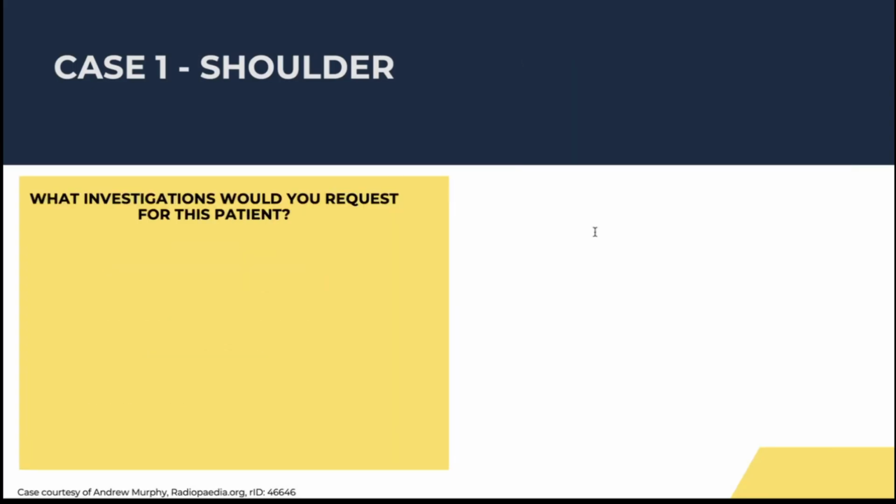And what investigations would you request for this patient? Well, given the nature of the talk, I'd probably get an X-ray first. That sounds like a really good shout. Thank you, Lauren. Yeah, shoulder X-ray. Do you know what views we would possibly do?